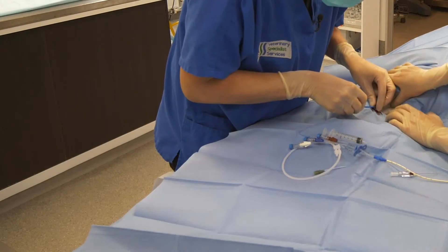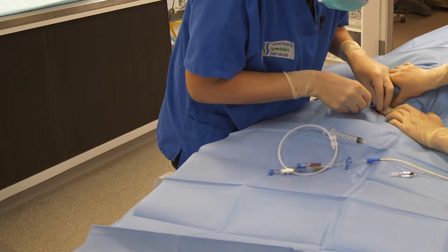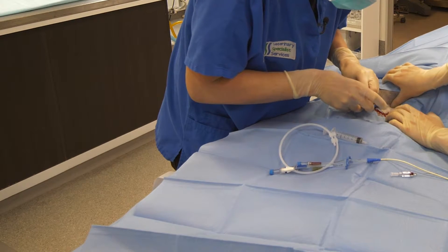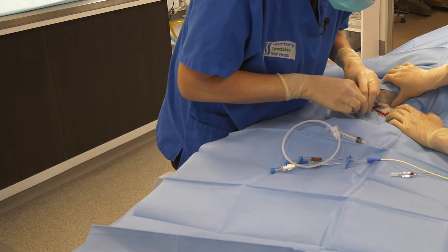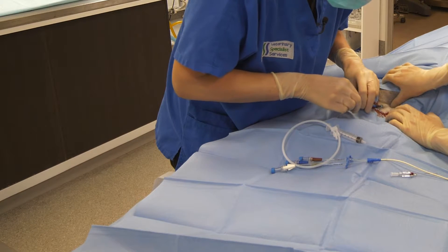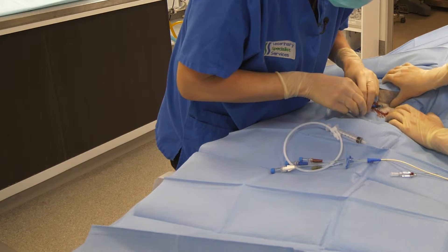And then we're just going to connect up the guide wire to our catheter, and then we thread the guide wire so that we're really comfortable that it's placed correctly.